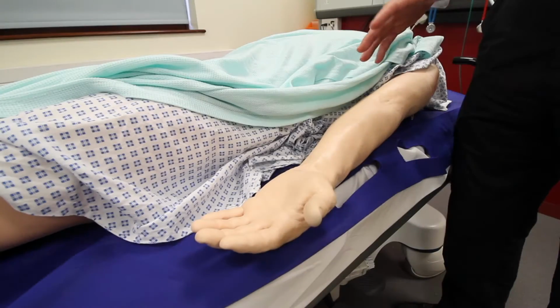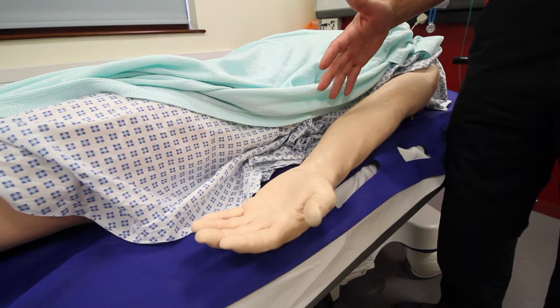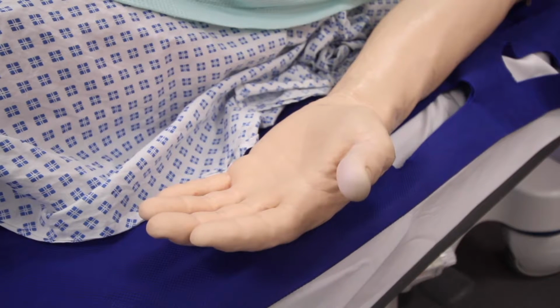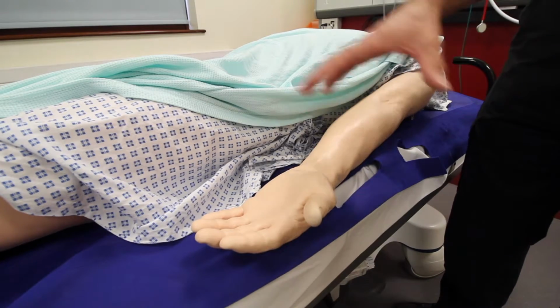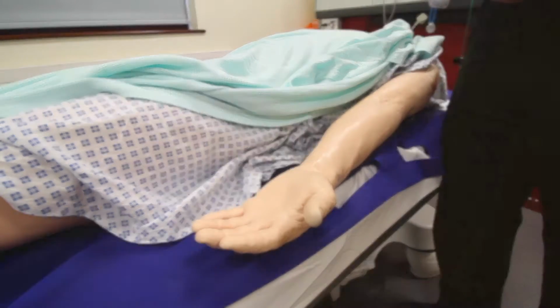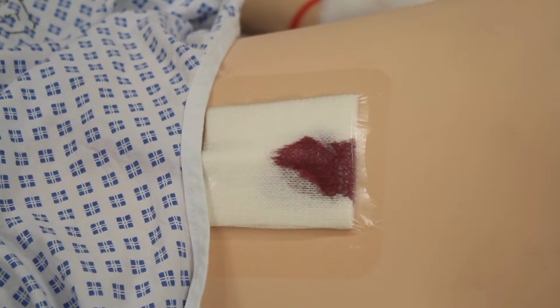And one of the functions that we're just displaying to you now is the fact that he's having a tonic-clonic seizure. It's not as you would expect in a real patient. His limbs tend to shake, and often he'll close his eyes and he'll have a bit of a clench down in his jaw, but you can see quite clearly that his arm is shaking here. So if you see this kind of motion when you're in your scenario, then he may be having a seizure. It's worth investigating that. As you can see, we can also make him bleed.